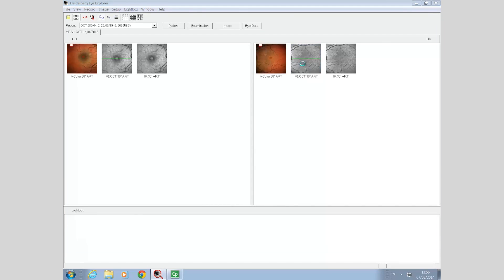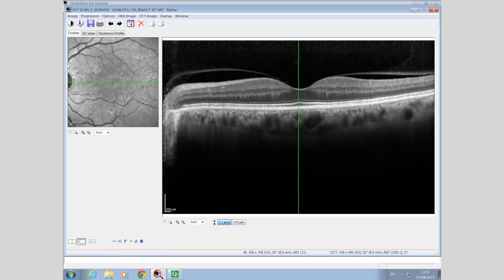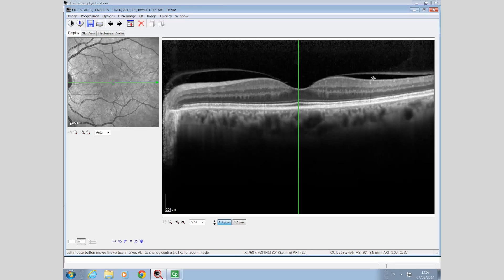The OCT reference image shows no obvious lesion, and the overall scan profile and foveal profile look normal. There is normal retinal thickness and no obvious intraretinal changes. Within the vitreous cavity we can visualise a partial posterior vitreous detachment with a firm attachment at the fovea.